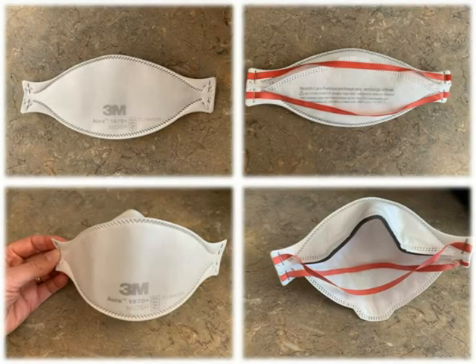The most common type of respirator used in healthcare is the N95 FFR. An N95 FFR is a type of respirator that removes particles from the air. These respirators filter out at least 95% of very small 0.3 micron particles, hence the number 95. FFR stands for Filtering Facepiece Respirator. The N95 FFR is capable of filtering out all types of particles, including bacteria and viruses.